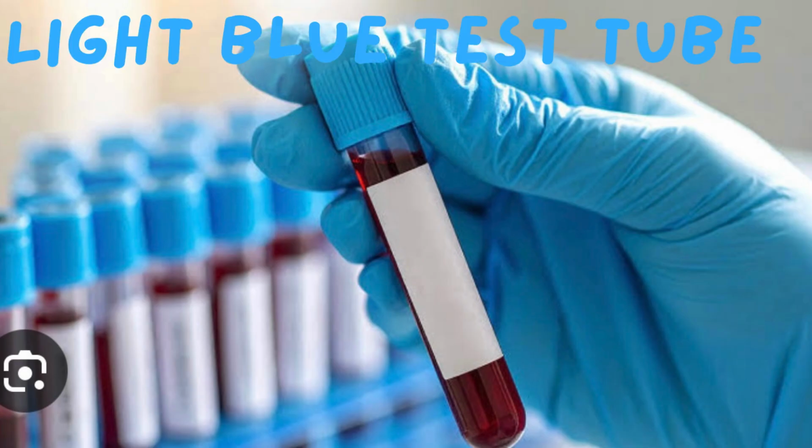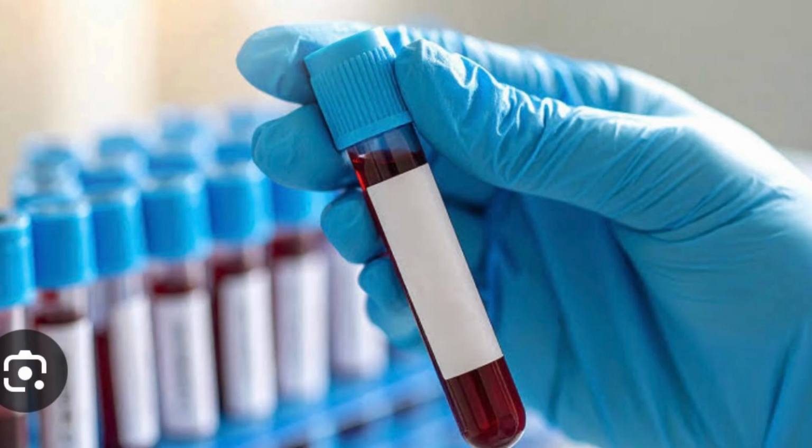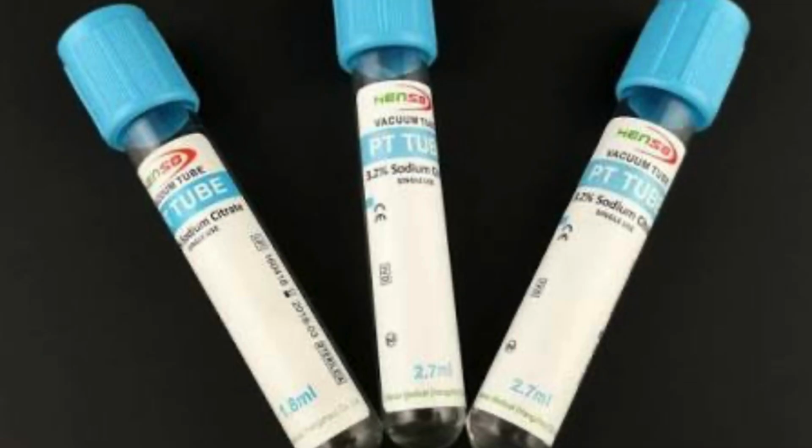Light blue top tubes contain 3.2% sodium citrate and are primarily used for coagulation studies and specialized hematology tests that measure blood clotting time. Citrate is an anticoagulant which binds calcium in the blood.